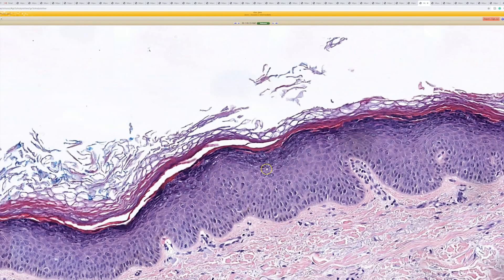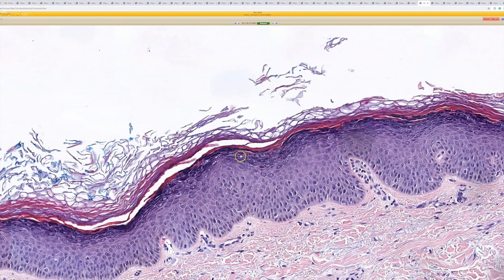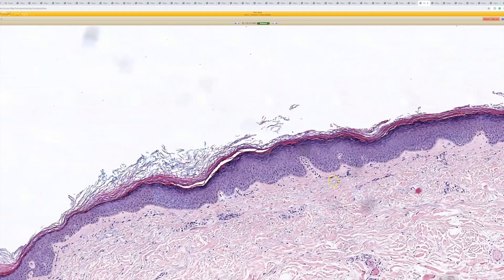Here's a good example of how you begin to get a pale change around the larger keratinocytes. My idea is this is an HPV effect — the cells are getting kind of larger. They're not actual koilocytes, but the nuclei get kind of larger and get a little pale space around them. So that's a nice example of Verruca Plana.